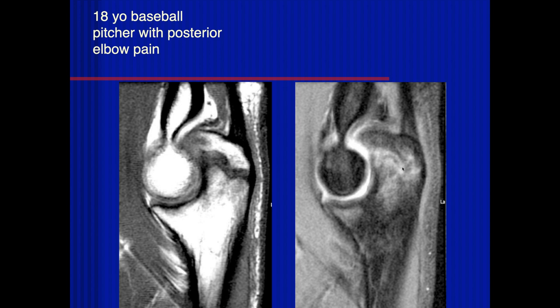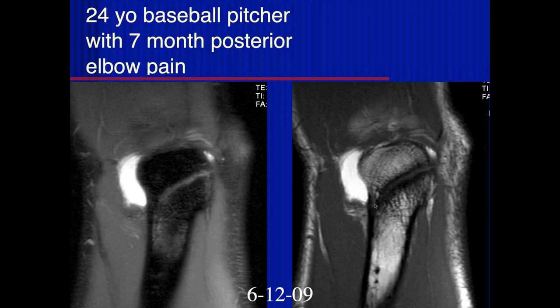So this is actually, you could say acute or subacute. This is a hot off the press baseball injury, where you have a traction injury with separation along the area of the growth plate. These actually heal very readily. If this patient stops pitching for 6 weeks, this will pretty much heal. So, as opposed to this next one, Michael, what's happening here?